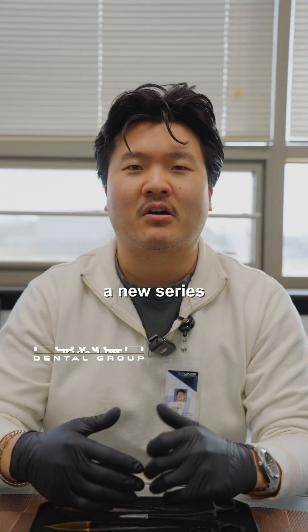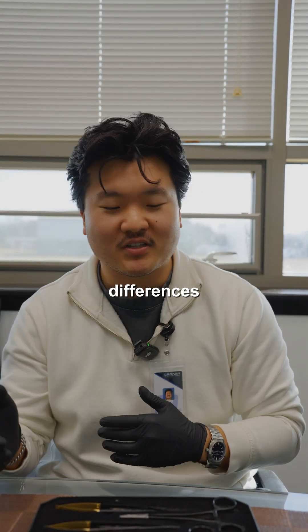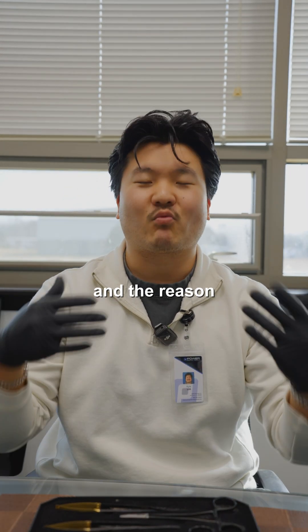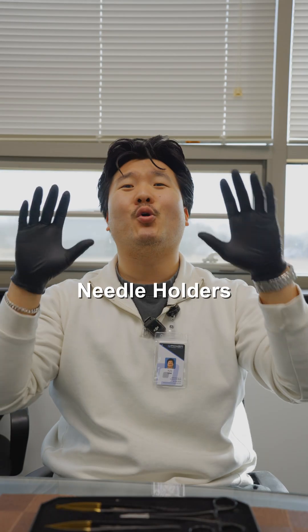What's going on y'all? It's Kyle Lim from Power Dental Group. We're going to start a new series called Instrument IQ, where we'll be discussing the primary functional differences as well as the physical differences between instruments, and the reason why you might choose one versus the other. So today we have a loaded topic — we're talking about needle holders.